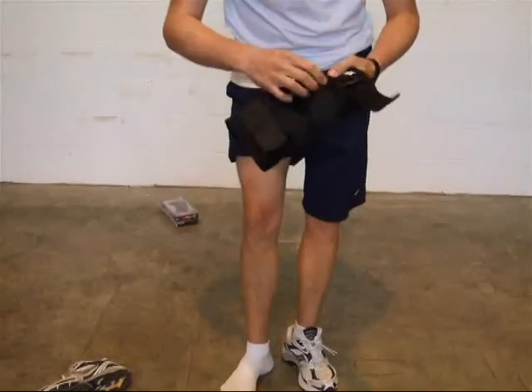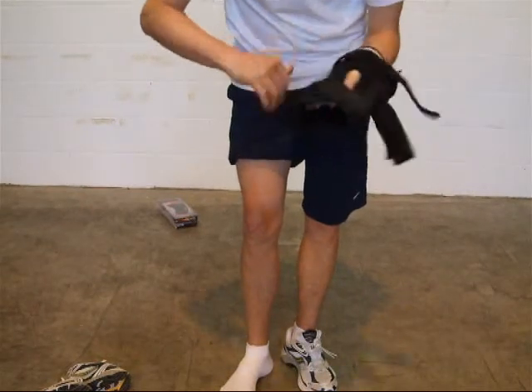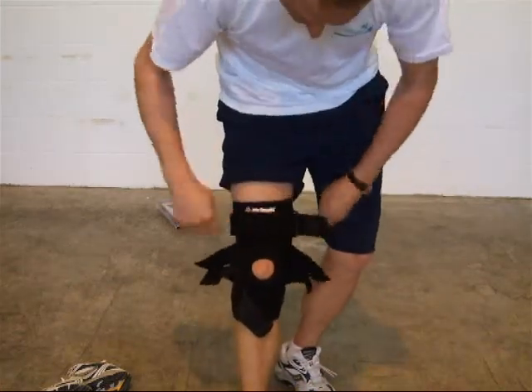This is a pull-on knee brace — simply slip your leg in and pull it up so your kneecap is in the centre.